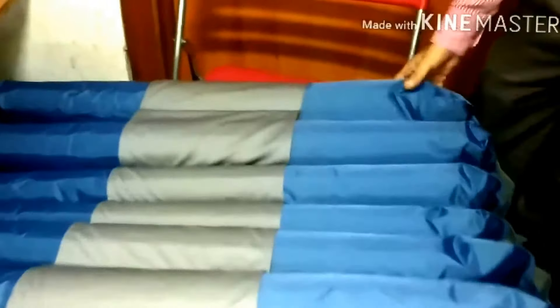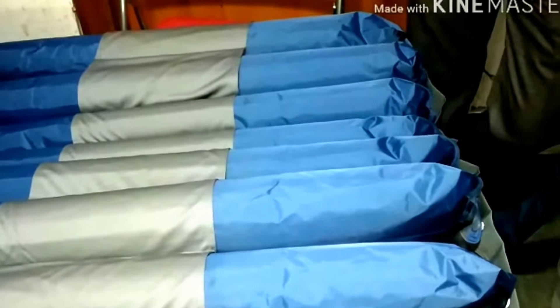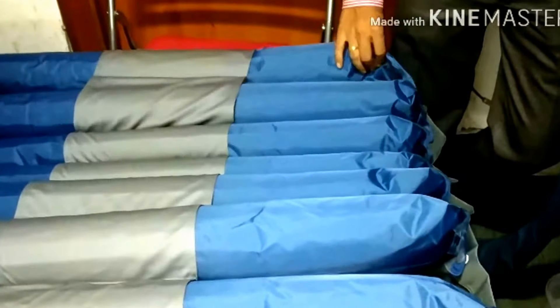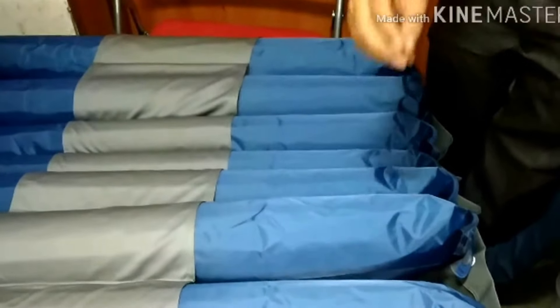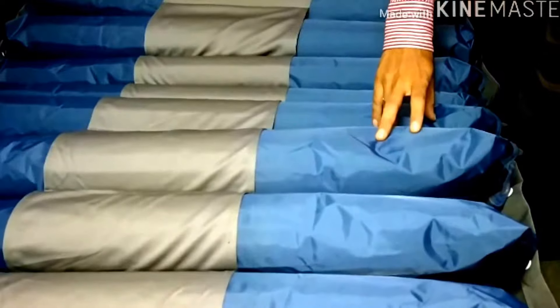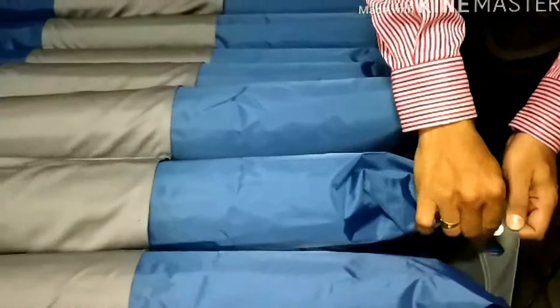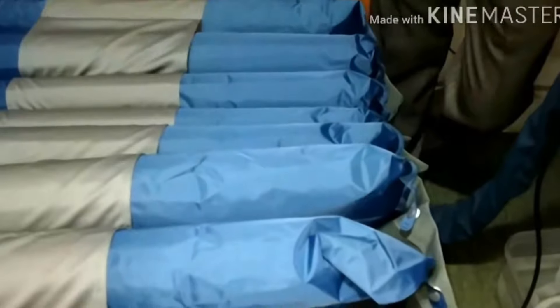These 21 cells are inflated and deflated depending on the pressure chosen in the machine. The advantage of these 21 cells is that if by chance any of the cells gets punctured, you can directly detach that cell and attach a new one. There is no need to change the entire mattress, making this a cost-effective solution.